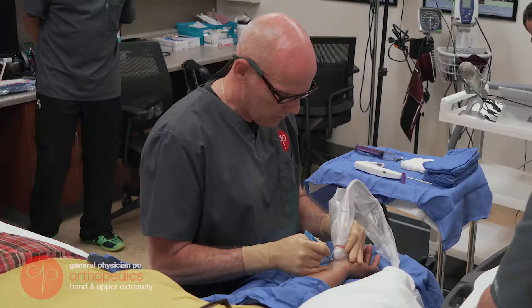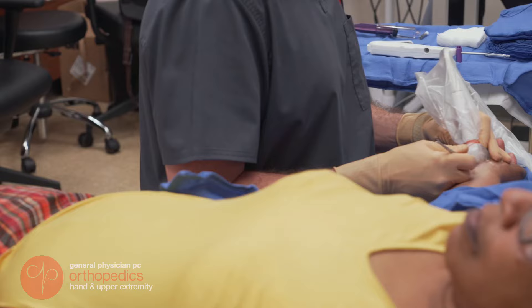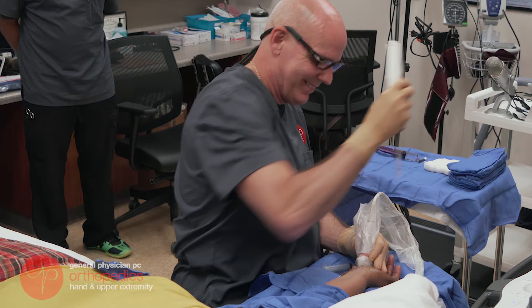The next step is to make a very small incision, about a quarter inch long. After that, a special instrument is inserted to clean off the undersurface of the ligament that we're going to cut, and the final step is to insert the special instrument and the knife into the carpal tunnel.